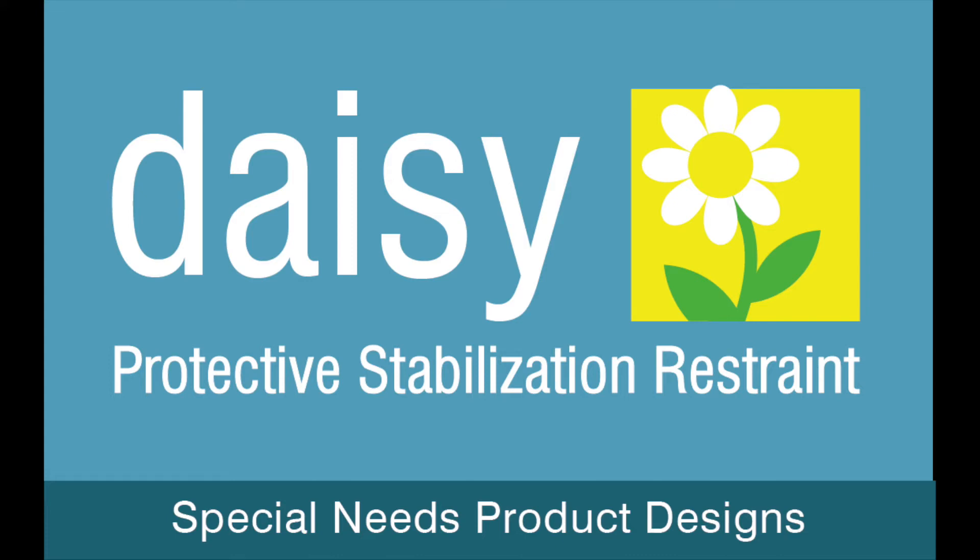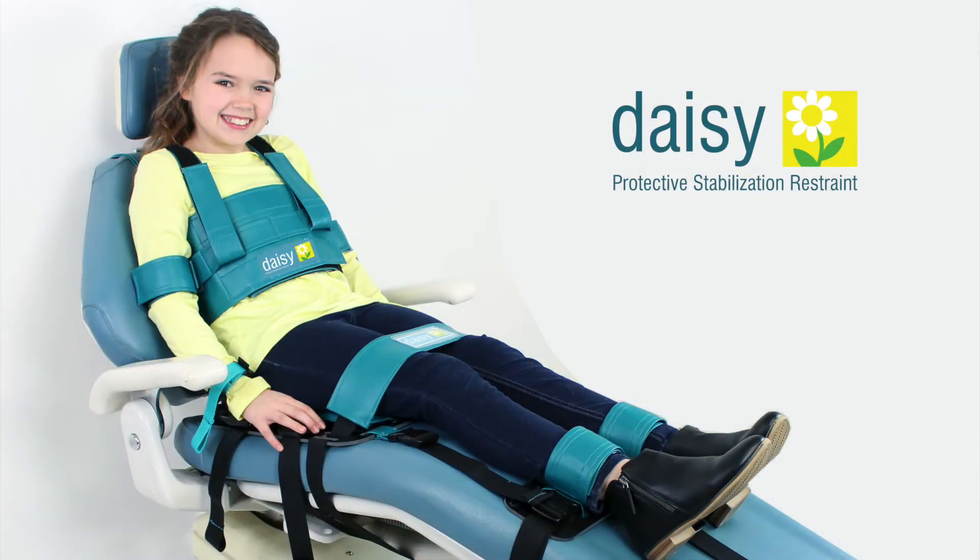Installing the DAISY PSR on the dental chair. The DAISY PSR is a protective stabilization restraint designed for dentists serving the special care community. This video will demonstrate the proper installation of the DAISY PSR to the dental chair.